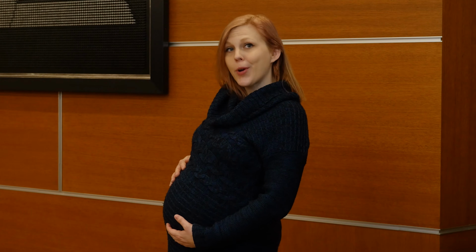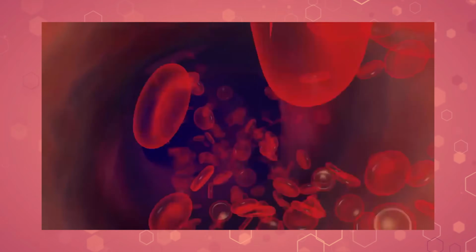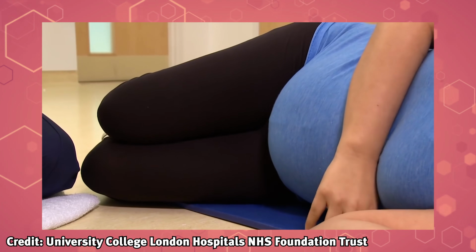What about women who are pregnant? Can you use an AED on a pregnant woman? You bet. There is no risk to the fetus during regular chest compressions or the shock from the AED. Just be sure that once the woman is in recovery, you move her to lie on her left side, as this increases blood flow to the heart and the fetus.